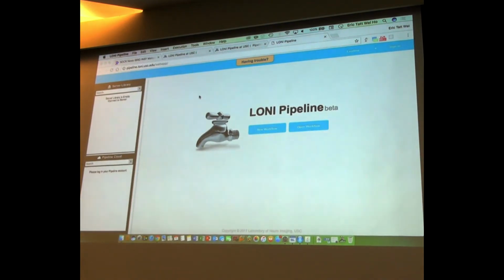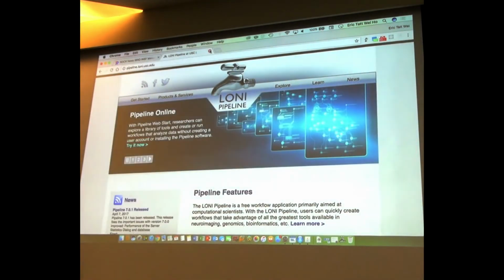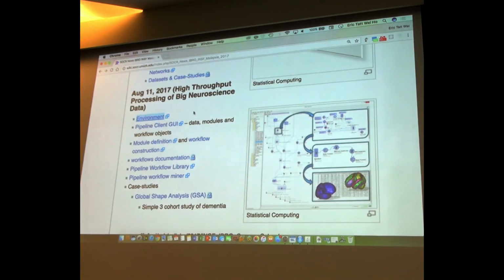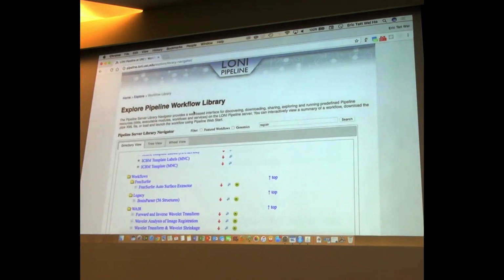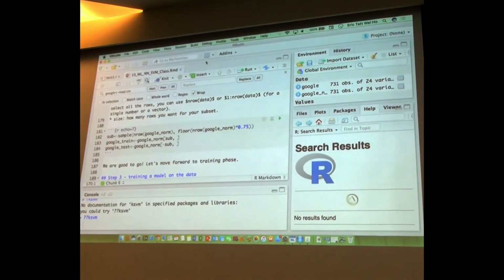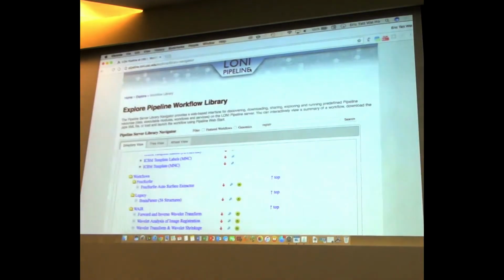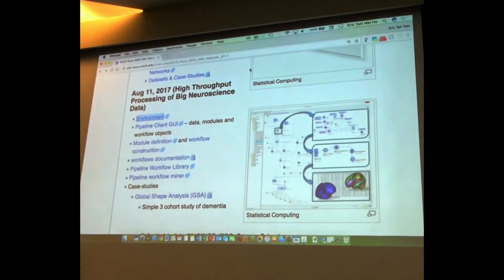Oh, but okay, tomorrow I'm going to show you some of the web app functionality. Okay, so the RStudio I can close now safely. Don't save. This we need, that we need.